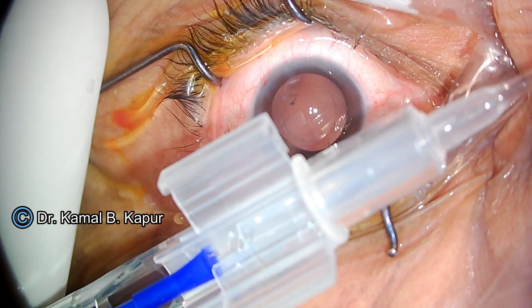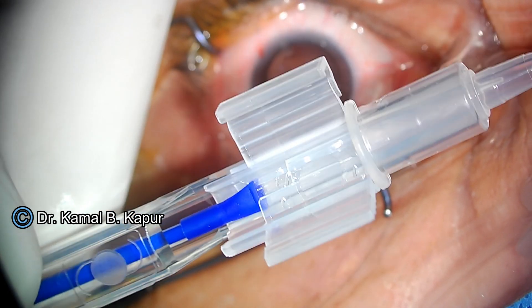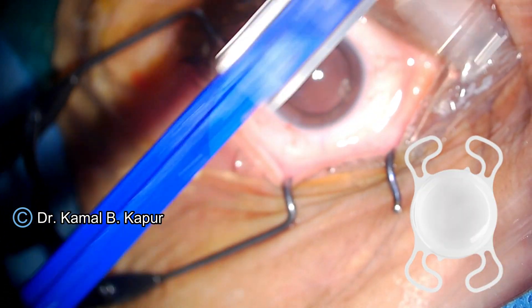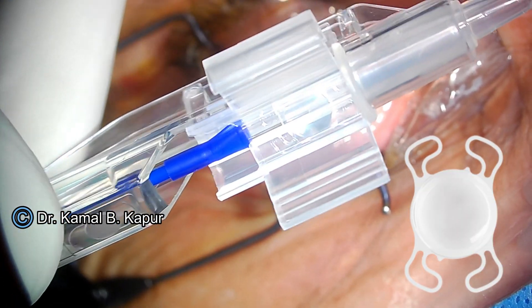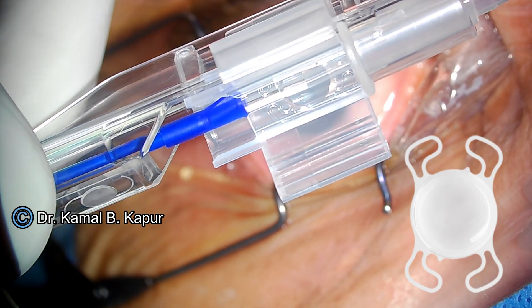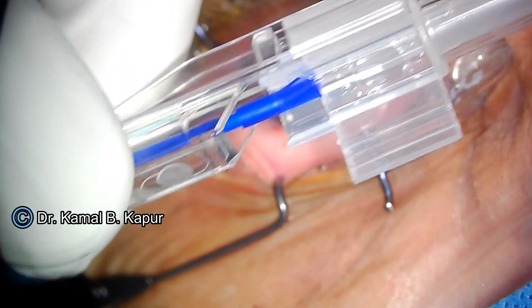Now this is how the Lux Smart pre-loaded lens injector looks. There is a covering or flap covering the lens on top. It is a four-haptic lens with a small nub on the right leading side and a nub on the left trailing side. We will show you the flap which covers the lens on top.